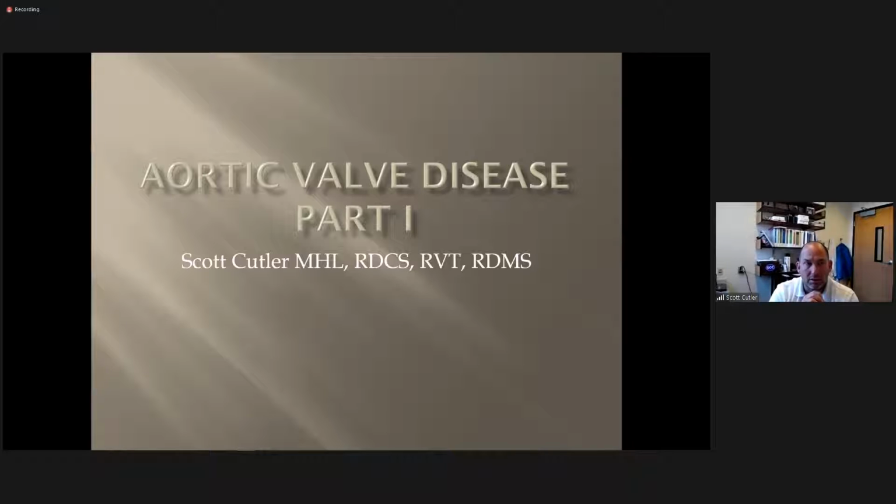For example, I had an aortic stenosis study. As a new graduate, every tech makes big mistakes sometimes. I just hope it's not a super big mistake. But I got through this study. It was an aortic valve stenosis study, and I was super proud of myself for getting this super high velocity, and I thought it was just the greatest thing ever. And then I got out, the patient's gone, and I'm writing up the study, and guess what? I forgot to take the LVOT pulse wave. Can I diagnose the aortic stenosis just on velocity alone? I cannot. I have to have a comparison to the LVOT.